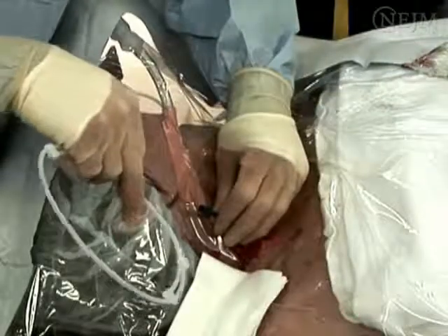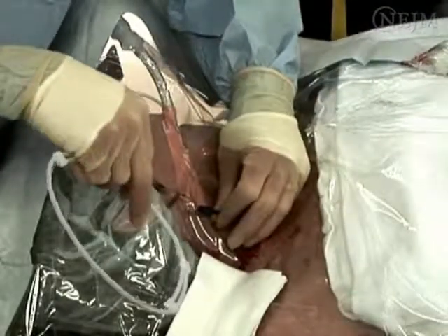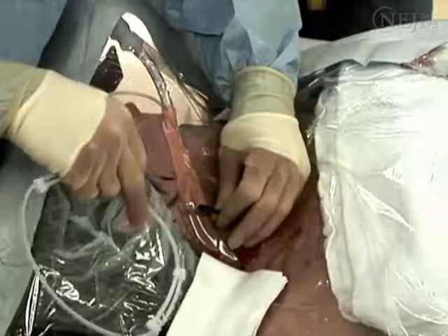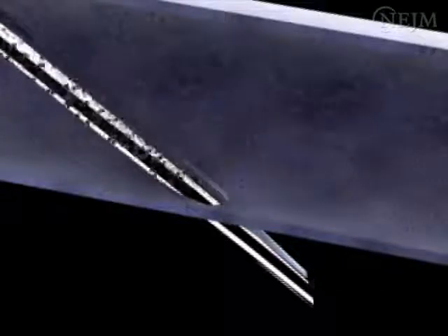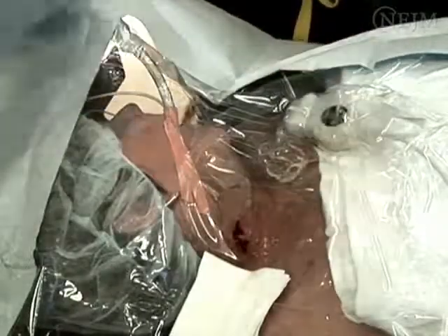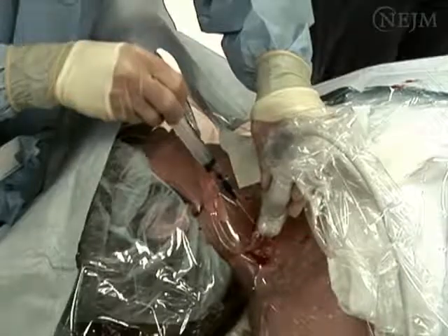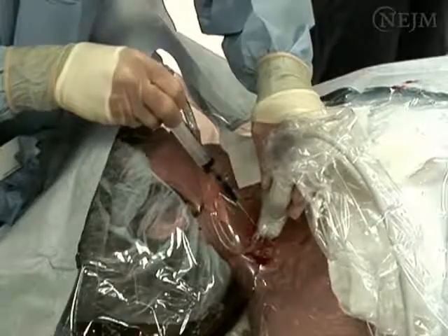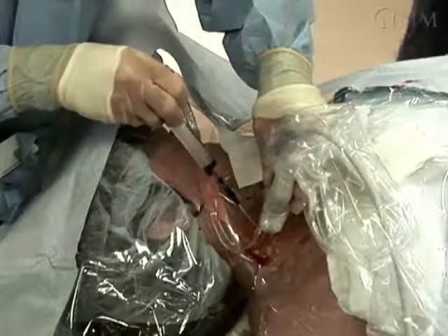If the wire will not thread through the needle, you may need to adjust the placement of the needle, since it may have inadvertently been advanced during manipulation. If so, adjust the needle and re-aspirate to be sure that you are still within the vessel. If you are unable to re-establish blood flow, remove the needle and start over. If the vein has been difficult to cannulate, the presence of a clot in the needle will further complicate assessment of whether the vein has been successfully entered.